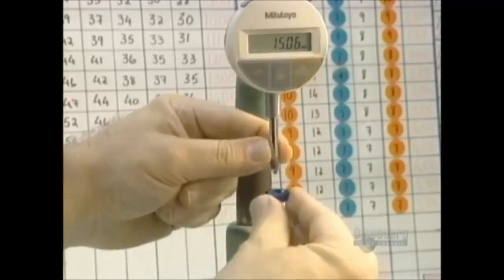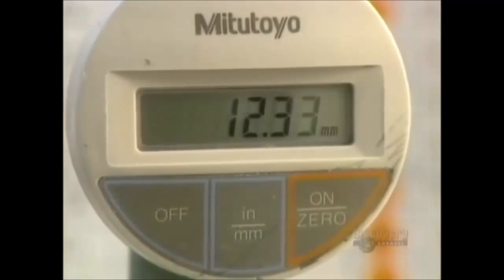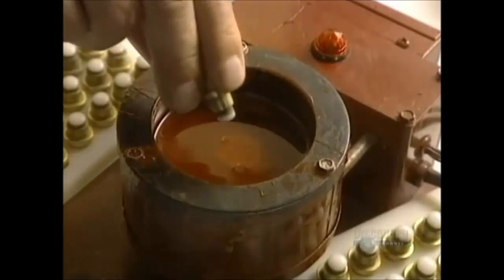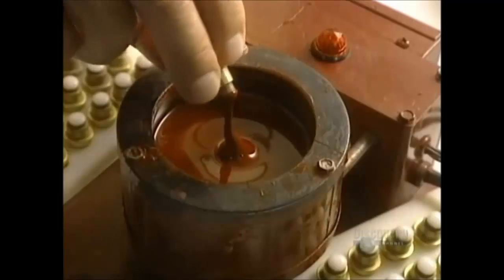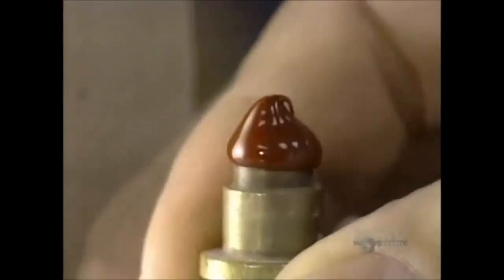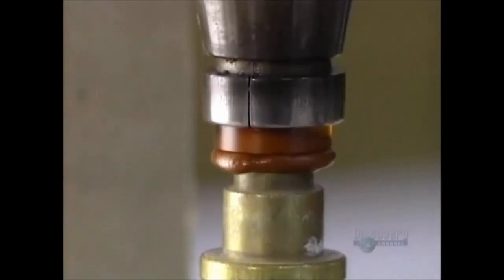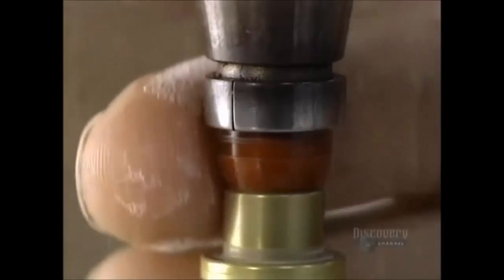A technician measures lens thickness with an extremely precise gauge. They now shape the outer surface, the part which touches the eyelid. The lens is glued with a special warm wax, and when the lens is completed the wax will be removed by an ultrasound device. The wax takes on the desired shape in just seconds.